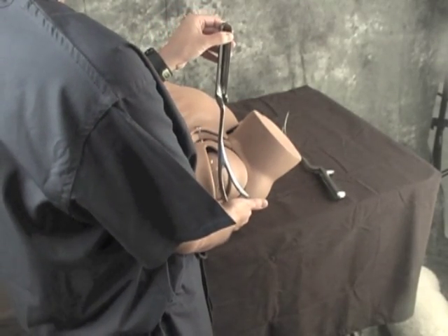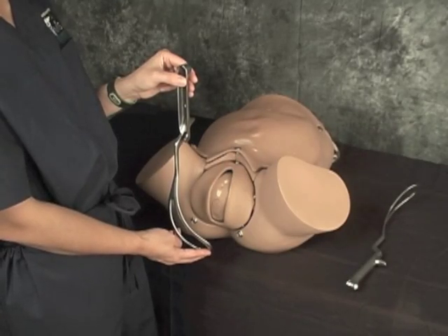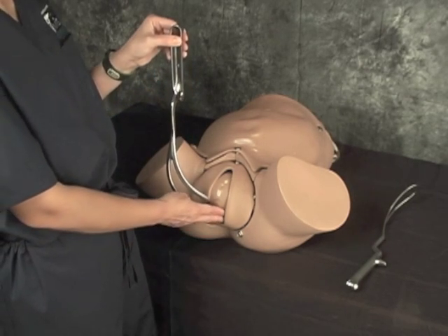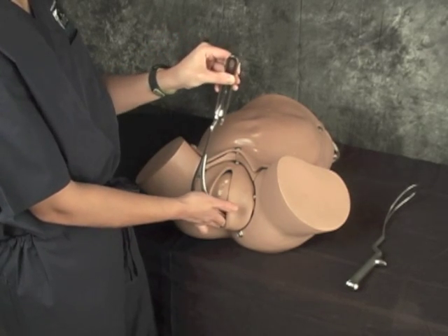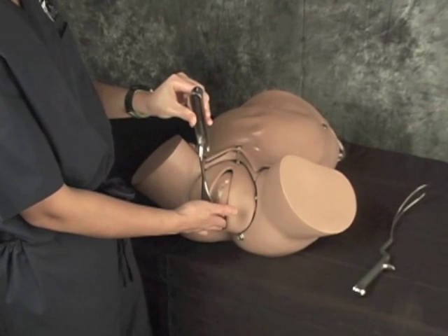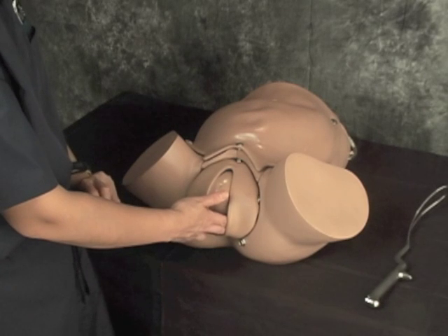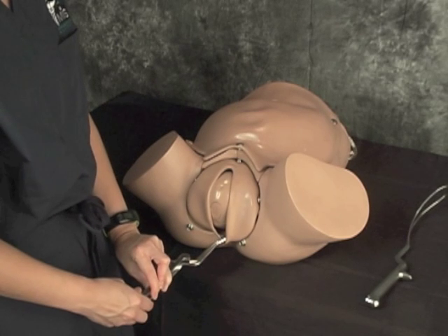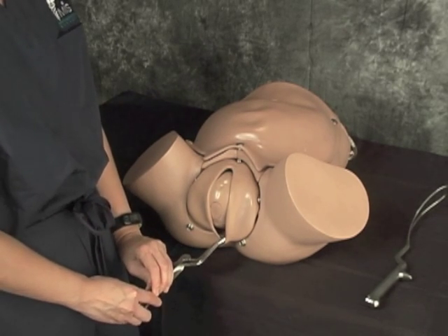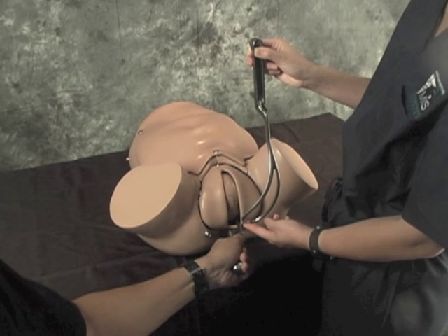The left blade is applied first to facilitate locking the handles because the lock is on the left shank. With your back towards the patient's right knee, insert your middle and index fingers inside the vagina and gently insert the left blade posteriorly in a vertical position. Arc the left forceps handle toward the patient's right thigh, then bring the handle towards the midline. You can ask an assistant to hold the left handle in place.